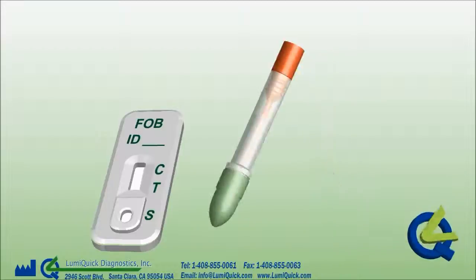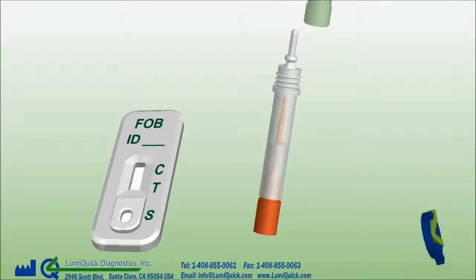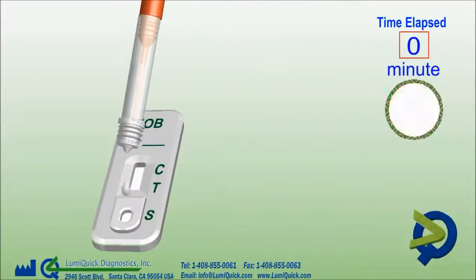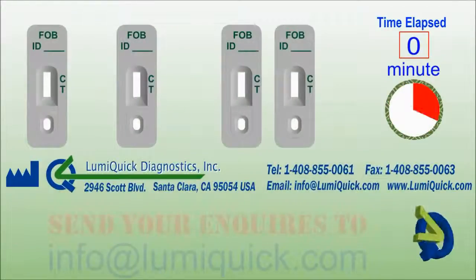Remove the green cap. Turn the tube upright. Snap off the tip. Turn down the tube and hold it in a vertical position over the sample well of the device. Deliver 3 drops of sample into the well. Read the results at 5 minutes.